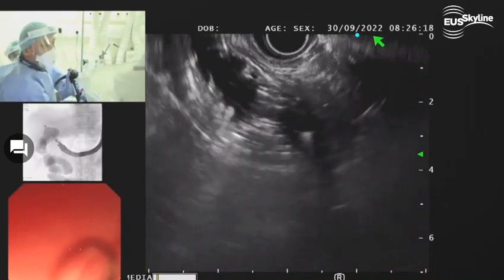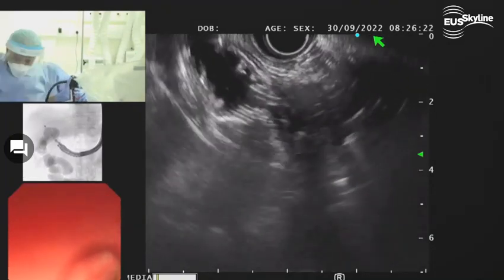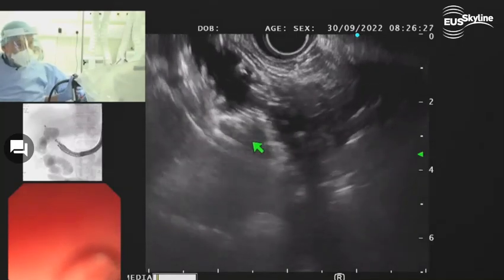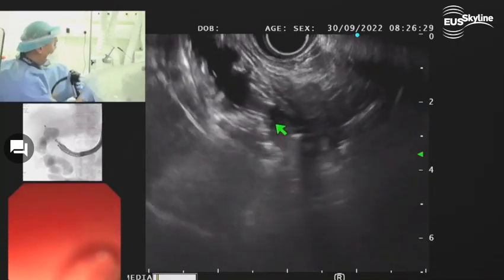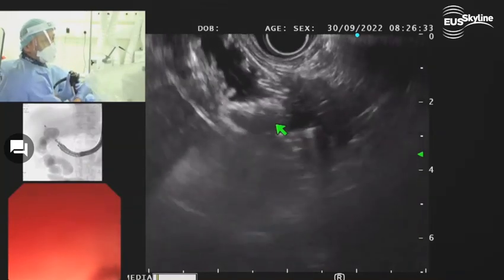All right. Here, right now, okay, that's the stent. Can you see this? We can see that. We can see the distal flange. Yeah, the flange. Clearly, the distal flange is in the bowel. Yes, in the bowel. Then I'm going to pull back the stent a little bit.